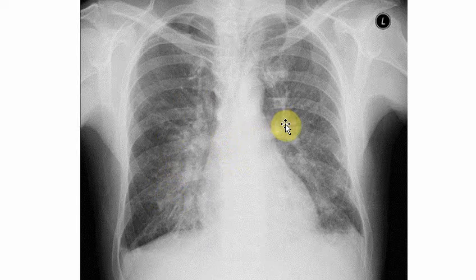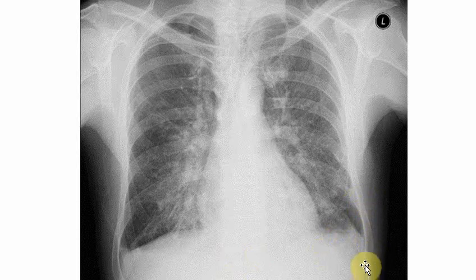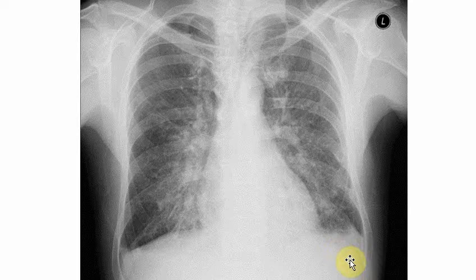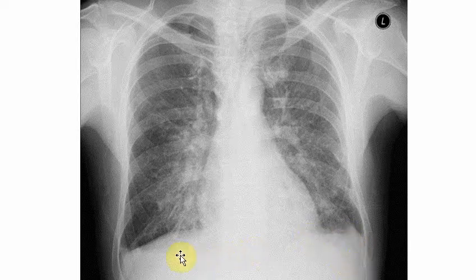Besides these patchy opacities, if you look at the costophrenic angle — which is where the ribs and the diaphragm meet — it should be sharp and dark. But here we see an opacity that even has a level, and the same is almost true on the other side. These are pleural effusions in the costophrenic angles, showing fluid build-up in the pleura.